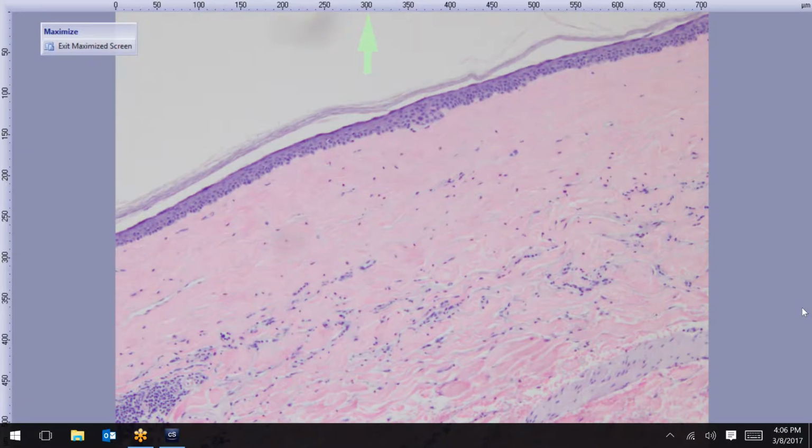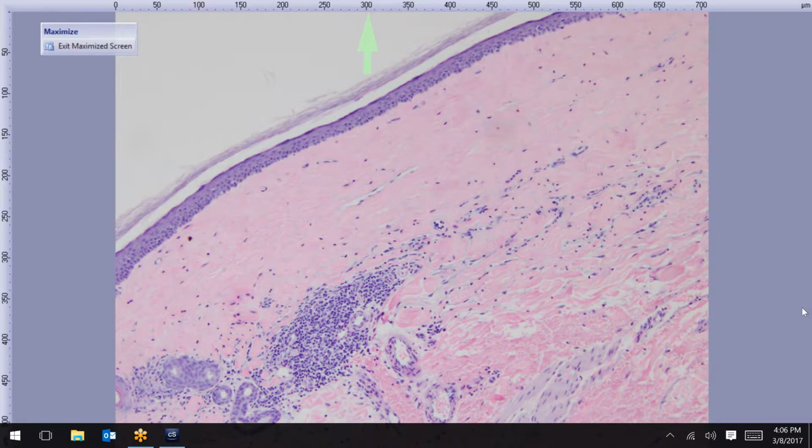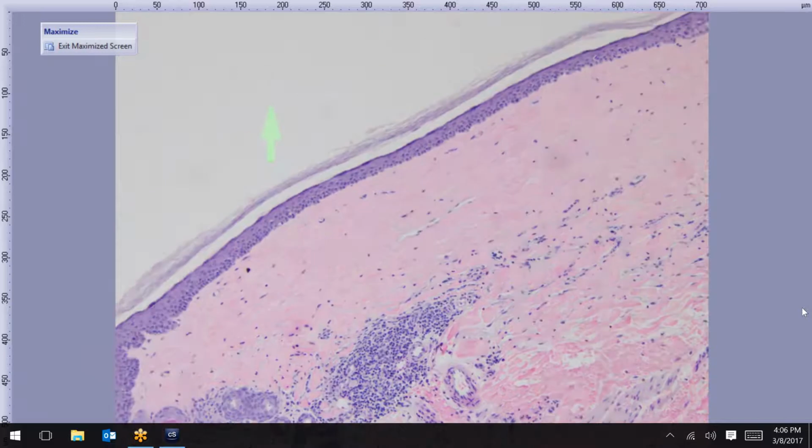All right, anyone just at this power here want to type in a diagnosis? Yep, that's right. Jackie said Lichen sclerosus et atrophicus, and this is really just a nice classic case. So we do sometimes get a little bit of plugging here.